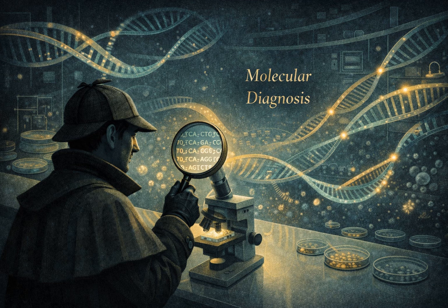You know what you're treating. It has revolutionized how we handle culture-negative infections. And for fungi, is there an equivalent? There is. The concept is identical. We just use a different target gene. For fungi, we typically use the 28S rRNA gene or regions called the internal transcribed spacers, or ITS regions. Same idea, different barcode.